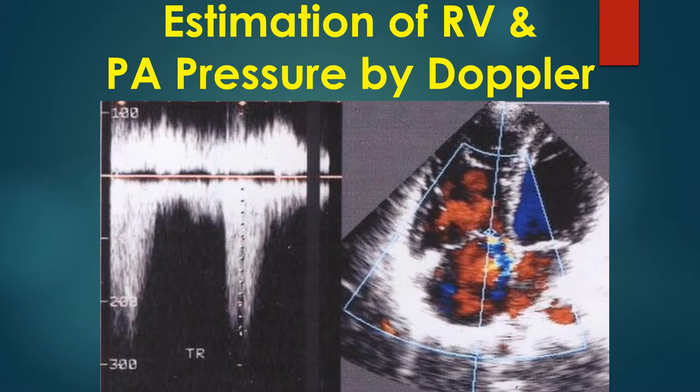The Doppler line is seen crossing the uppermost portion of this jet. The Doppler spectral tracing is seen in the left panel. It is a tongue-shaped jet and the peak velocity is measured using the cursor.